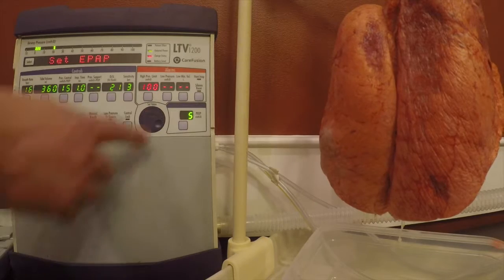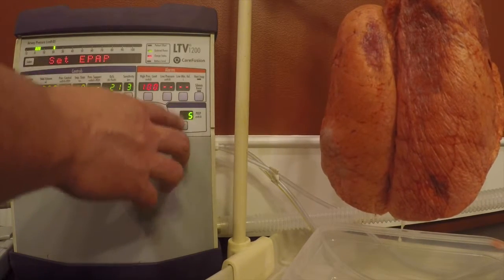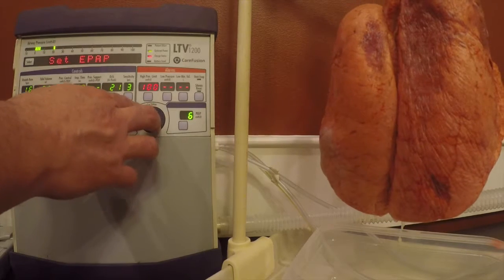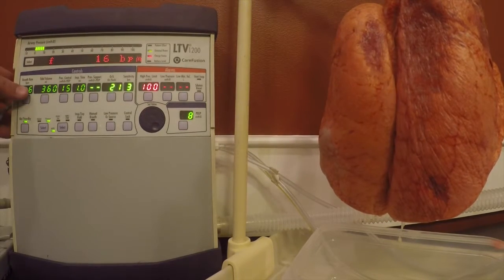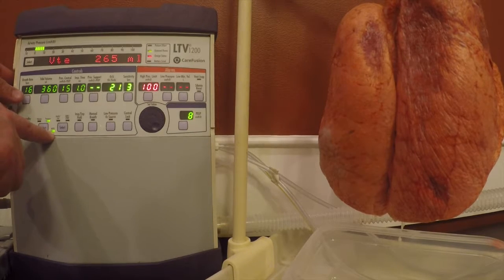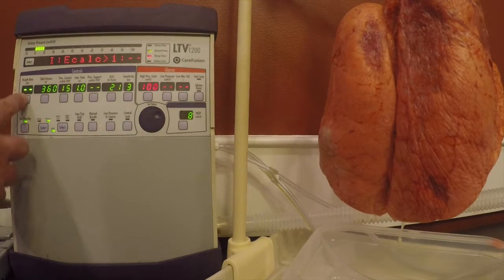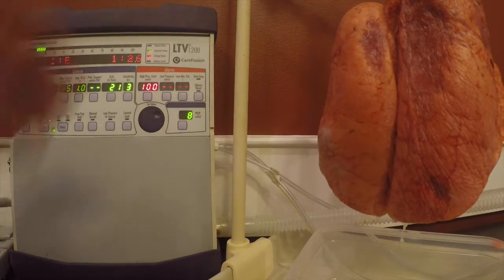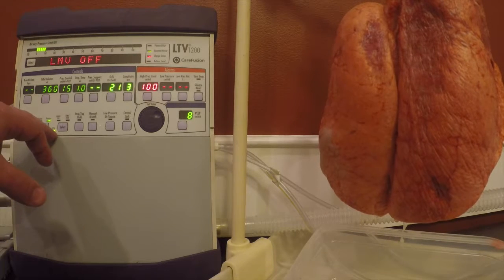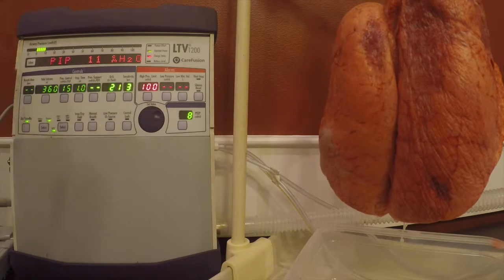You can see now that our EPAP lights up and we're at 5. Let's say we want an EPAP of 8 — hit select. The next thing we want to see is this light stop blinking, go solid, and we turn our rate to 0. Now we're actually in non-invasive positive pressure ventilation. We have no pressure support, so we have no IPAP, and we have an EPAP of 8.